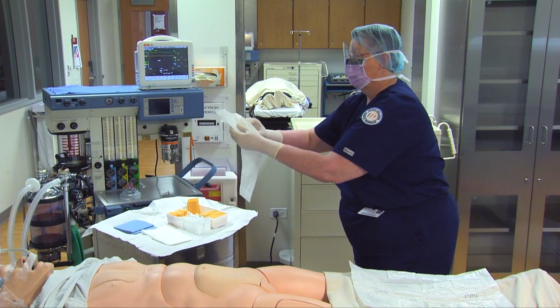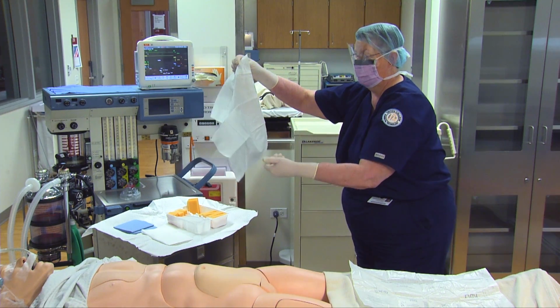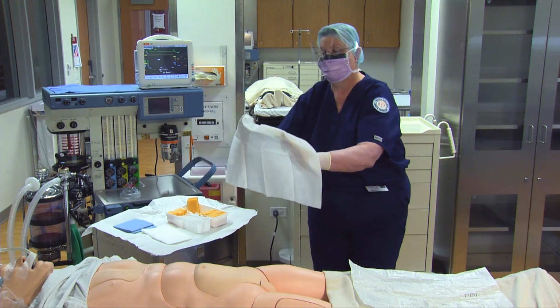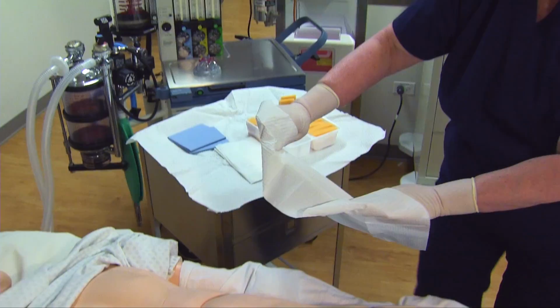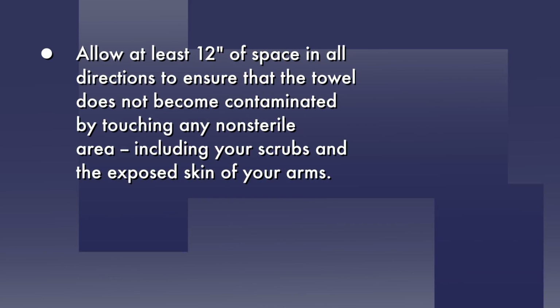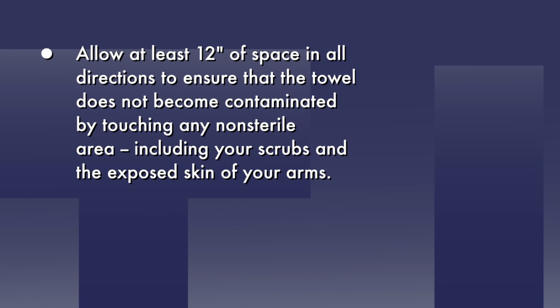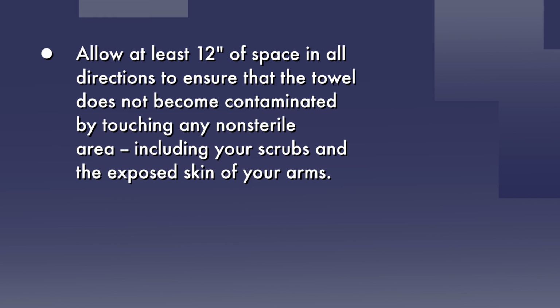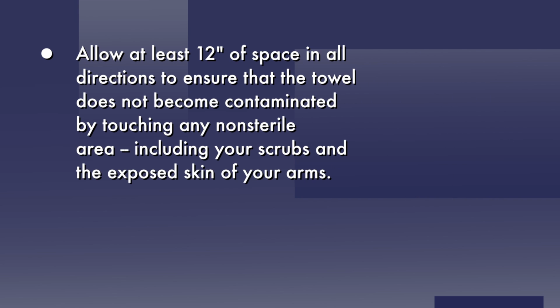Lift the first drape towel from the prep set and open it. Grasp the corners of the towel with your thumbs away from you, and roll the towel over your gloved hands to protect them as you slip the towel under the patient's torso. Allow at least 12 inches of space in all directions to ensure that the towel does not become contaminated by touching any non-sterile area, including your scrubs and the exposed skin of your arms.